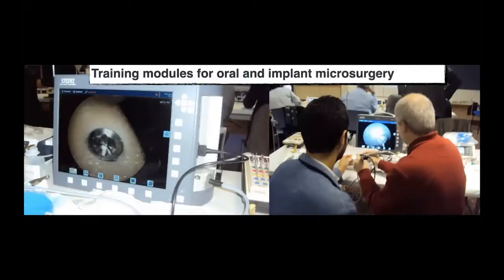It is necessary to undergo some training in a specially designed phantom before performing actual procedures in order to gain experience in the use of this equipment. We have given several training courses on this technique and instrumentation with the support of the Karl Storz company from Germany. Unfortunately, due to COVID-19 pandemic restrictions, it hasn't been possible to continue with this training course during the last 2 years.